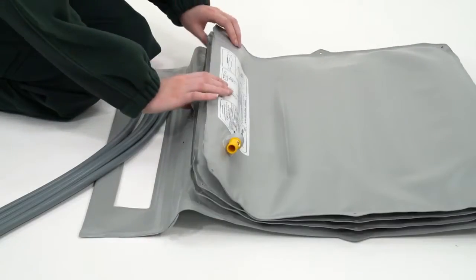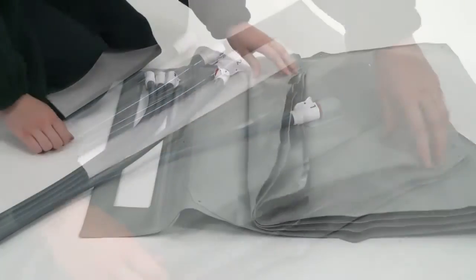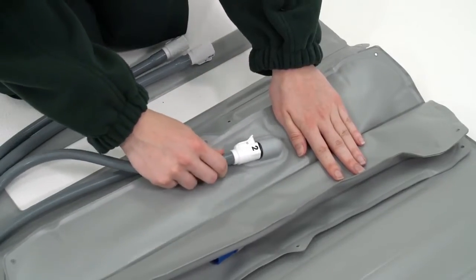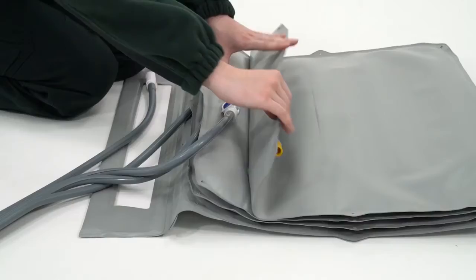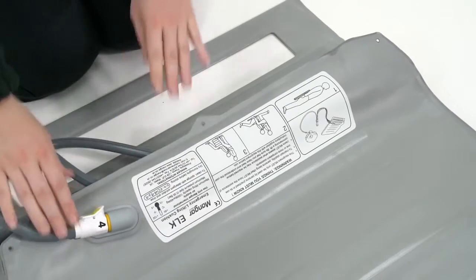The four colored and numbered airlines are matched and simply connected to each section of the Elk. The remaining airline is connected and the on-off button is pressed. The Elk is now ready to use.